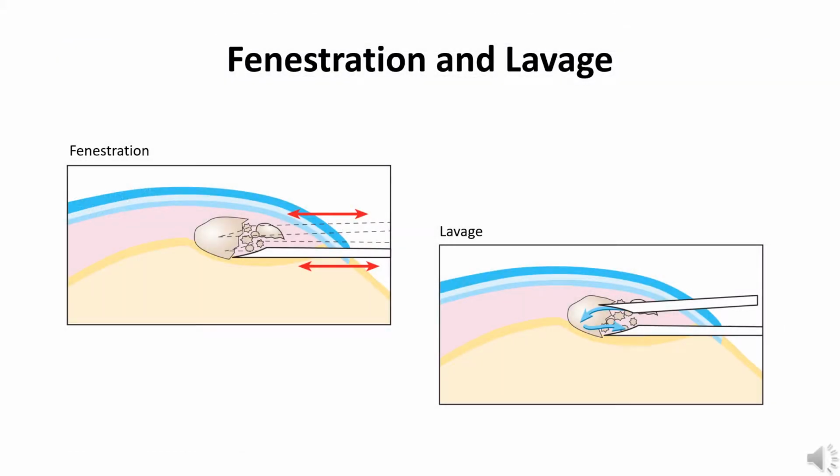This illustration demonstrates the technique of fenestration and lavage. On the left hand side of the screen, you'll see fenestration. Please note how the needle breaks up the calcium. There's a kind of stabbing motion, very similar to chipping ice.